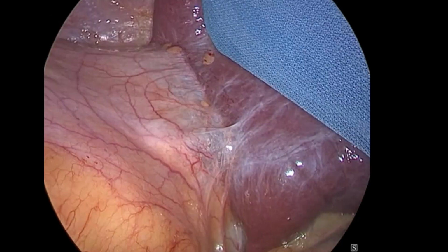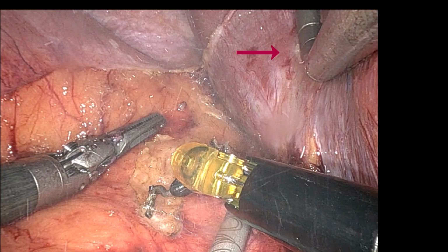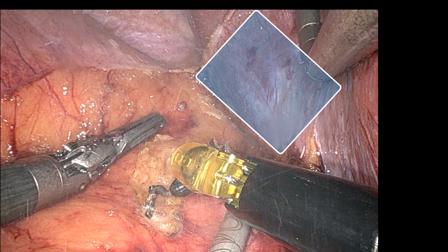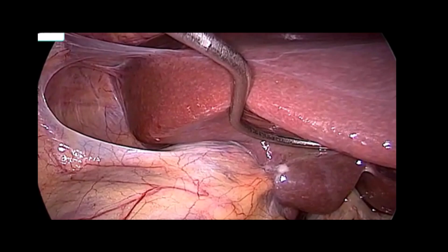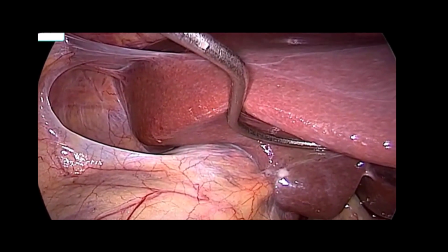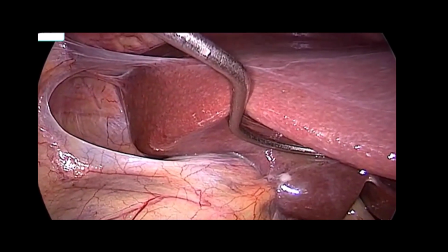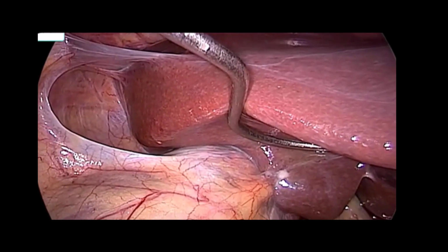This is the view we want to achieve so that we can start to identify the adrenal and do our dissection. We'll talk about paddle retractors in a bit. Theoretically, one could use the Nathanson to achieve similar retraction, but I don't usually see that in the videos I find online. However, the Nathanson does not get nearly as much purchase in the liver as the paddle retractor. And on really friable livers in obese patients with steatohepatitis or in those with Cushing's syndrome, the Nathanson and other retractors can lacerate the liver. The paddle retractor allows for broad retraction across a wider area and tends to slide less.